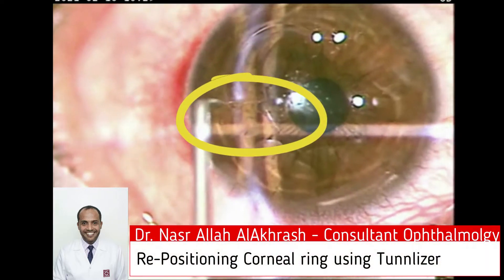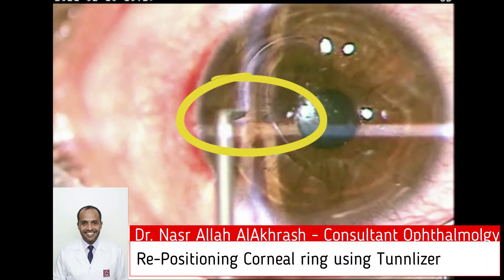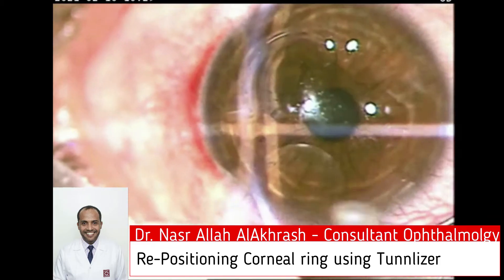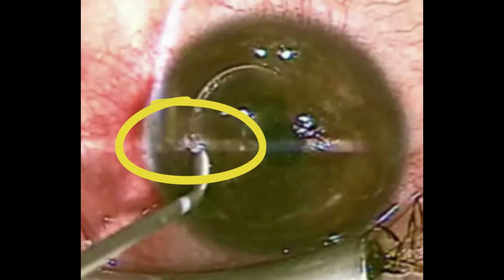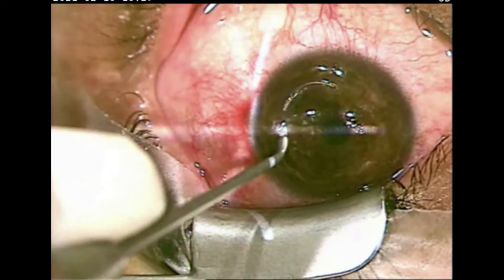Hello everyone, I'm Dr. Nasrallah al-Akhresh, consultant of Ophthalmology. In this video, I would like to present a case of a corneal ring which is not very well centered.